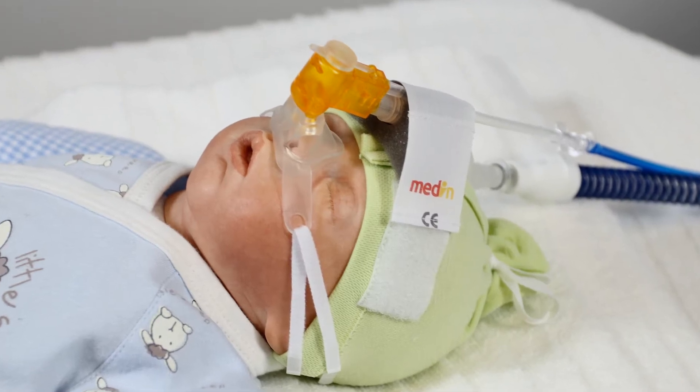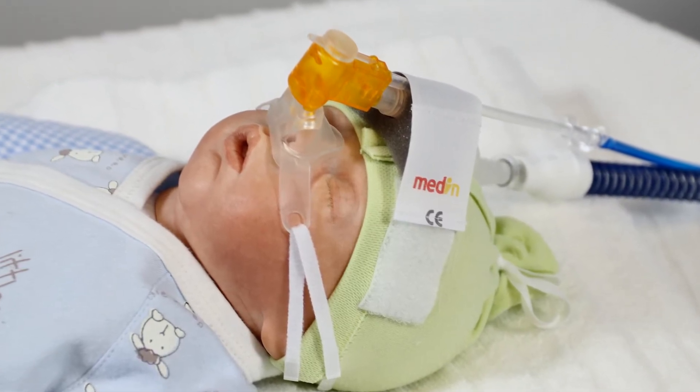This short video demonstrates correct use of the Medin NC-PAP interface for neonates.